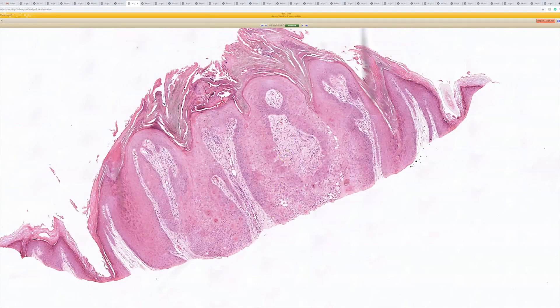Sometimes these can really have almost like a dumbbell shape. They can really push way down a follicle. And I feel like they often have some keratinocyte atypia because they're often inflamed and irritated.